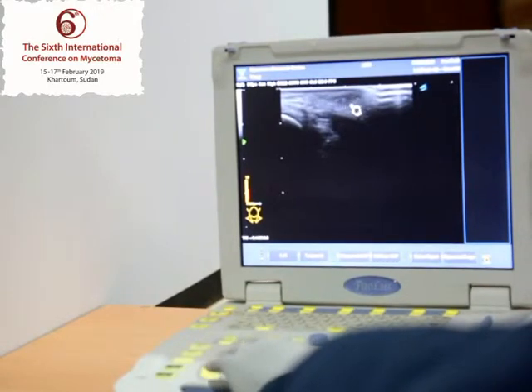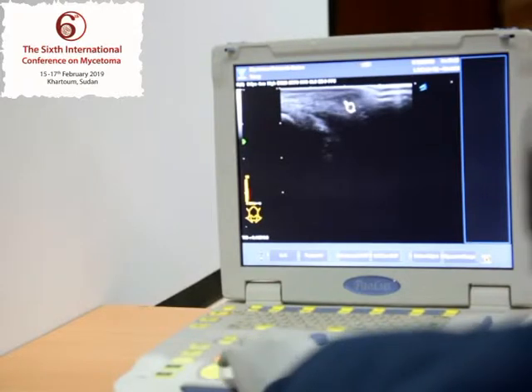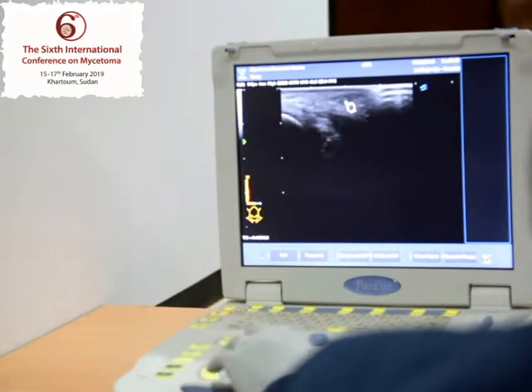As you can see, this lesion has a wall, and the white structures which are located here are the grains. They have sharp echogenicity. We can see them very sharply, in comparison to the case of an actinomycetoma, which you will all see with me.